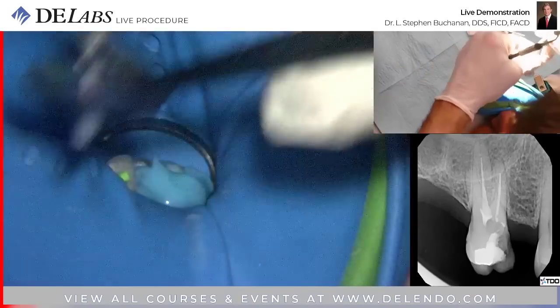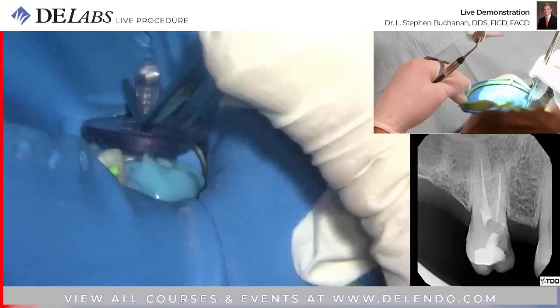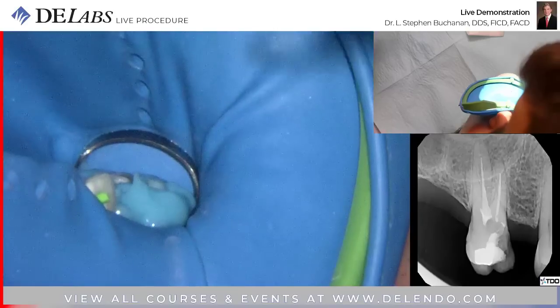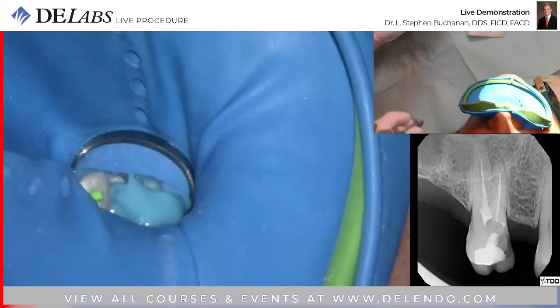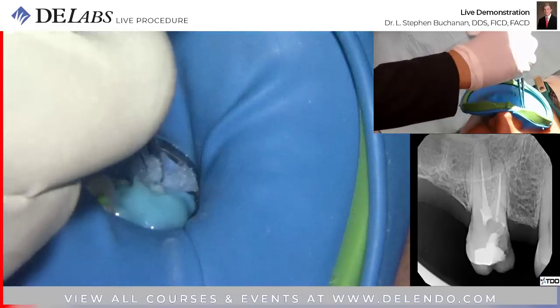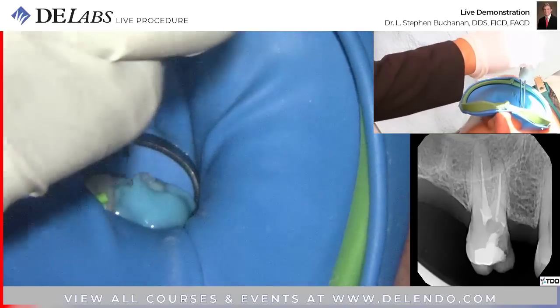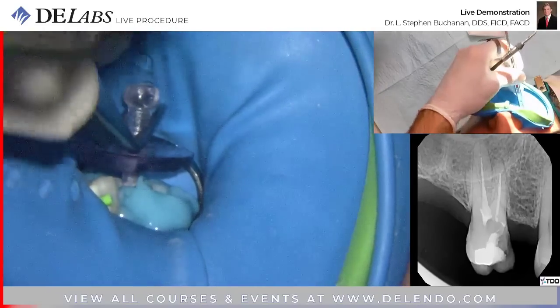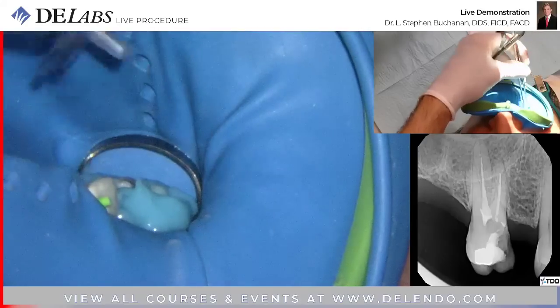This is the platform former that's going to go in the access cavity, like that. So I'm going to load half of it. Go ahead and put that in this access, please. Yeah, you only put 2 of those cones in. That's just because I'm not close to the distal buccal palatal. It was just because they're on that mesial wall. Okay, that's good. So you're just going to go down there. Great. Okay.